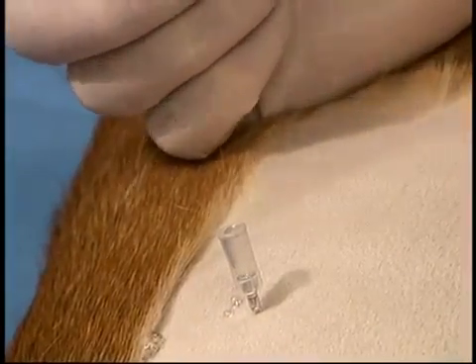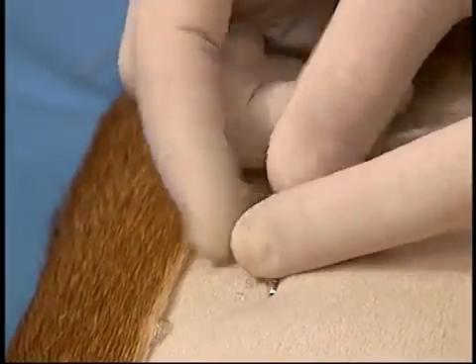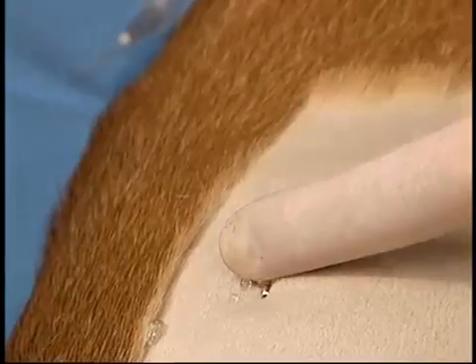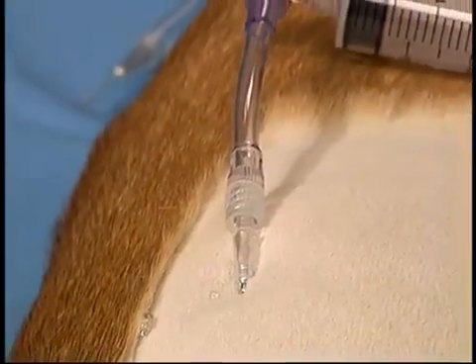Once in, the needle is advanced two to three more millimetres, and then turned laterally, hooking up underneath the ribs, parallel to the chest wall, and the Centesis valve chest drain adapter is attached and aspirated.